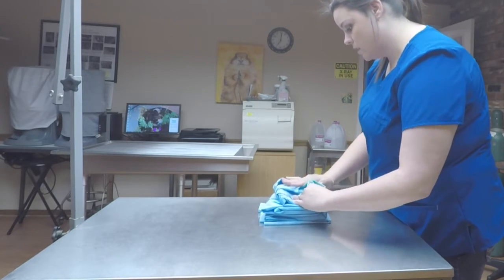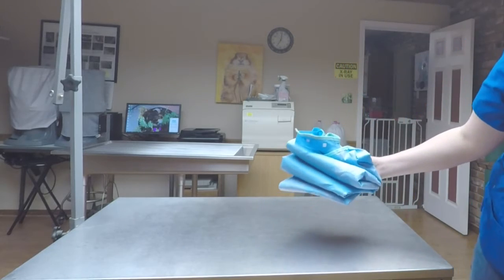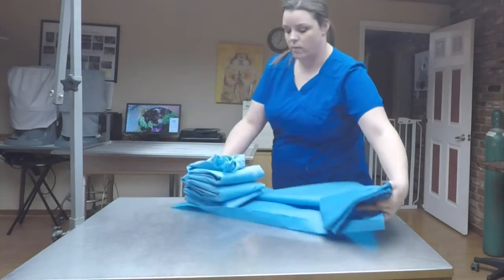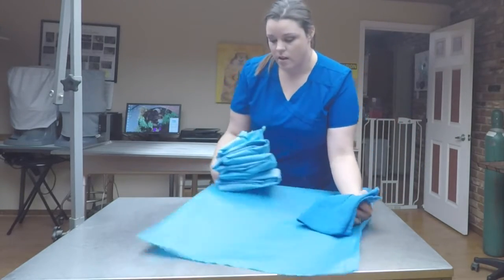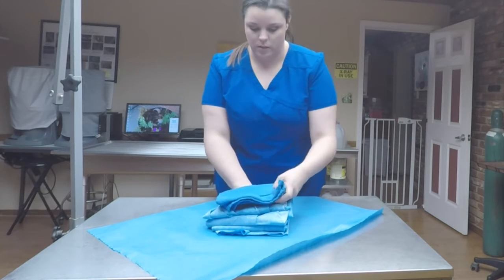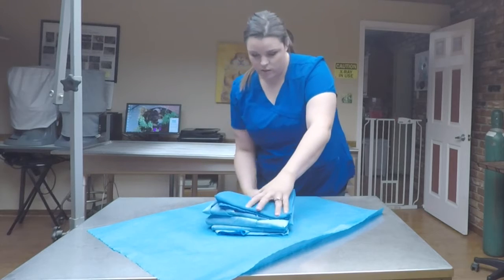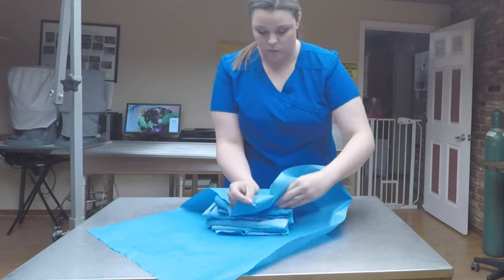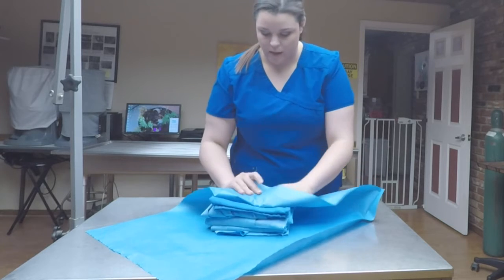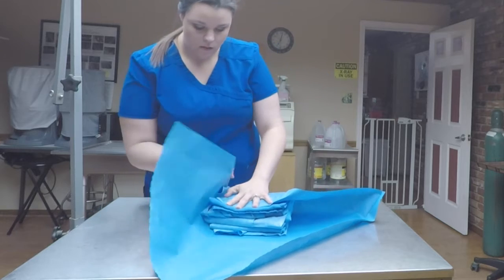Ties at the top. Okay, then you will get your wrap for the gown. Going to sideways, and in the same manner, you're also going to want to include the towel for the doctor or the surgeon. Going to fold in half here, and then fold backwards to create a tail.